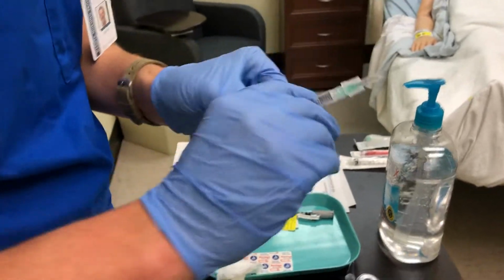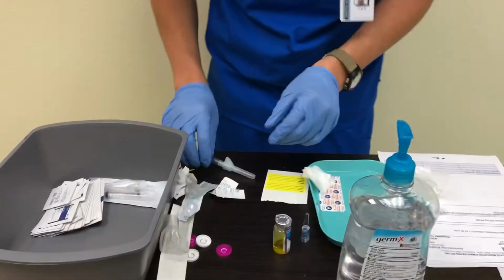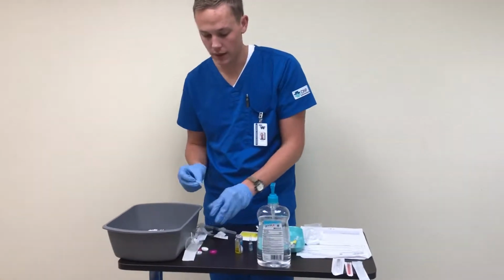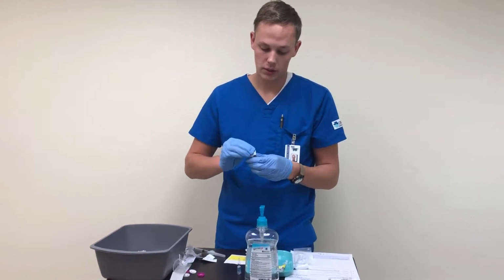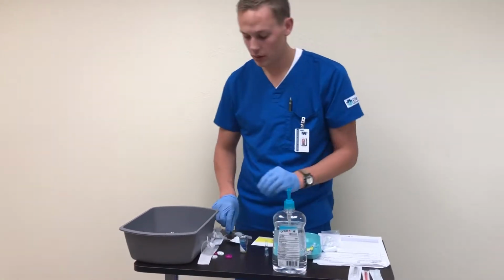So I'll pull it to 1 mil, insert it. Before I do that, I have to wipe it down again. After I mixed it, you always gotta wipe down your vials. So that's again for 10 to 15 seconds. Okay, so now we're ready.